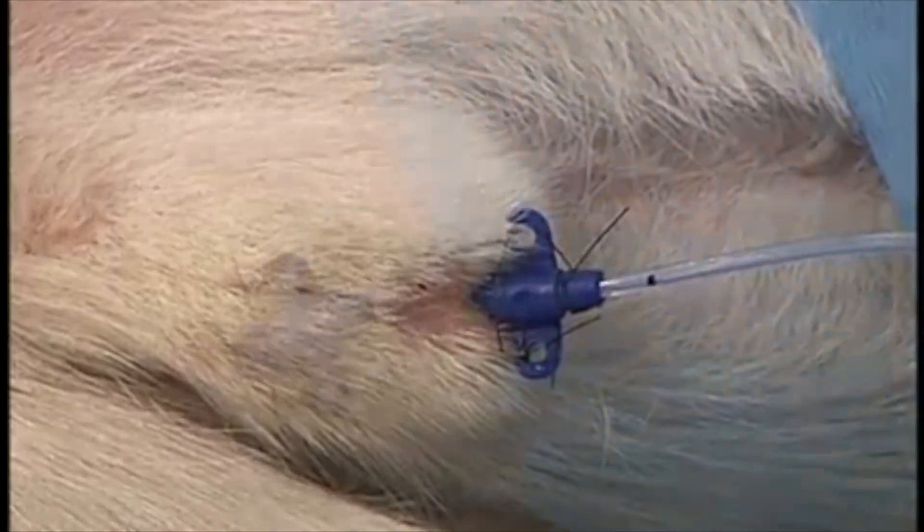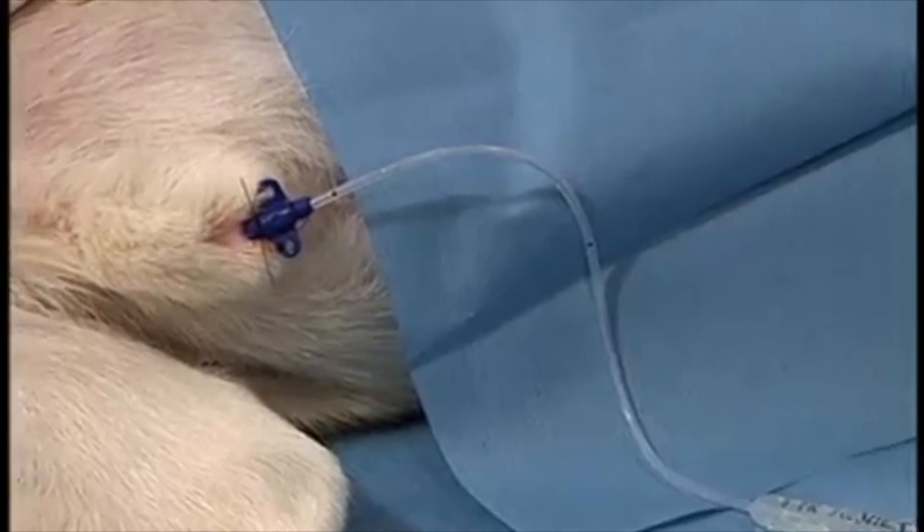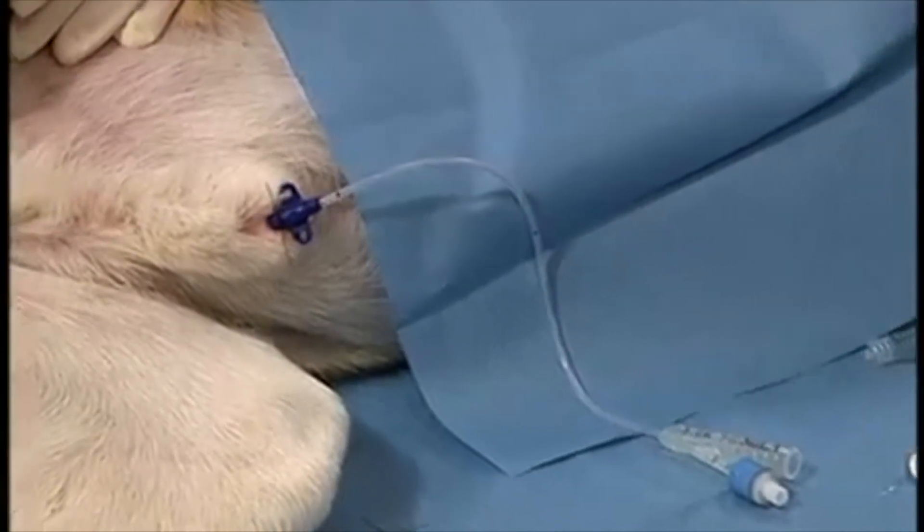Once the catheter is being sutured to the prepuce, the balloon is inflated with three cc's of saline. This will prevent the animal from being able to urinate around the catheter.